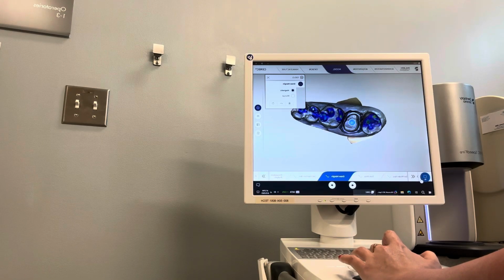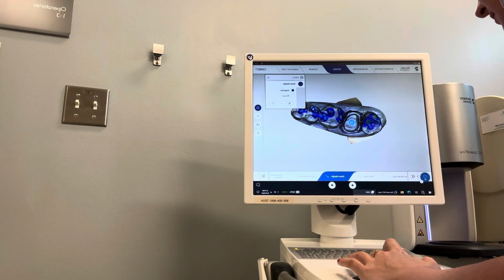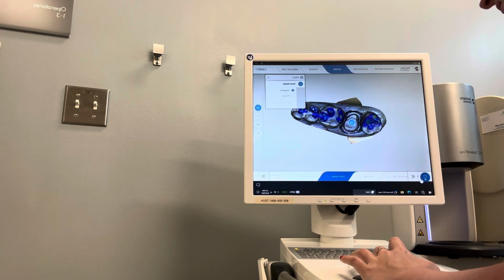That means they were able to fabricate a good bite registration, occlusal, or model axis and everything on its own without manual manipulation by myself. So it brought me straight to the margin design. And so now I'm going to select the magnetic selection instead of manual and use that to help me draw my margin around the crown.